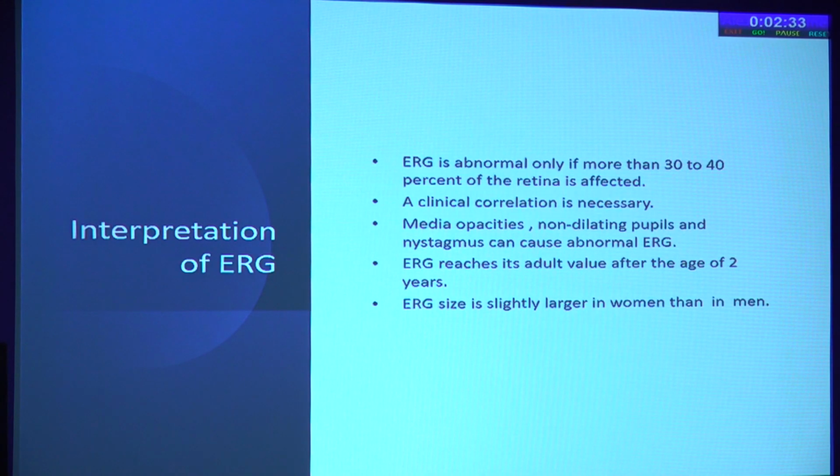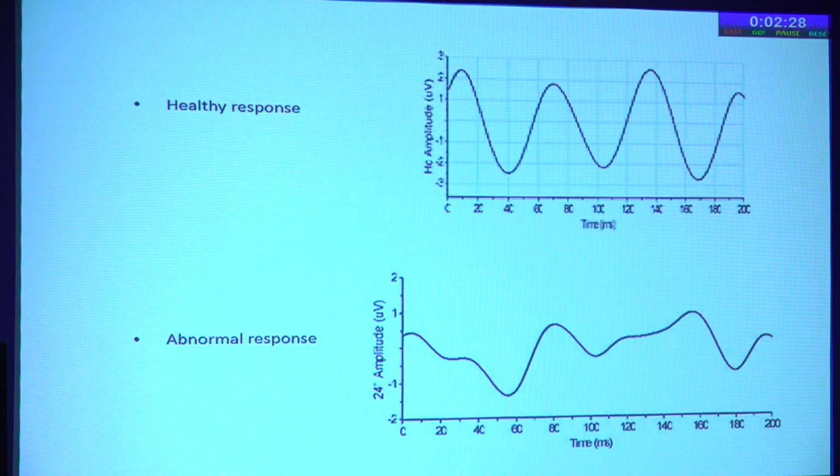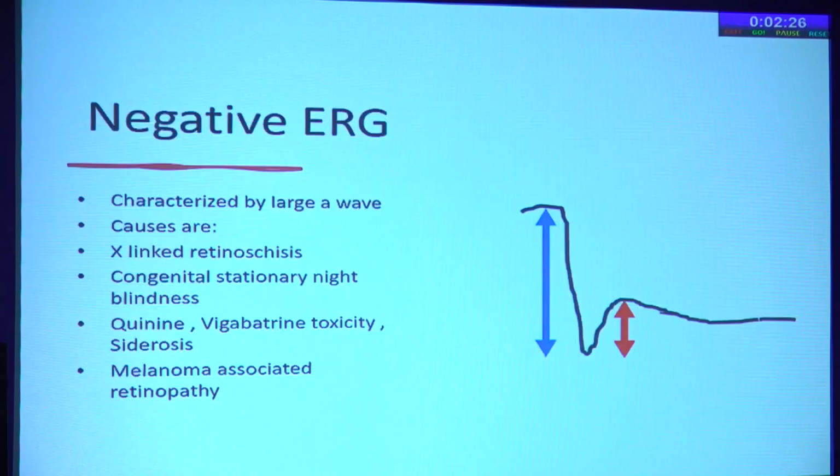So that's what we think. I'll come back to glaucoma and diabetic retinopathy, it can be very thought-provoking. So this is a healthy response, and another is an abnormal response.